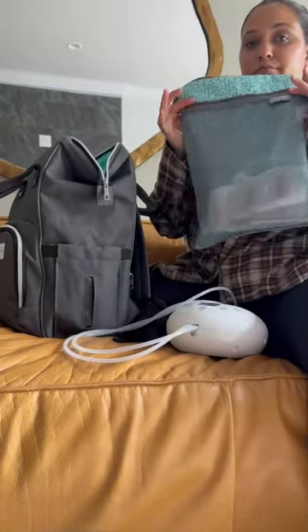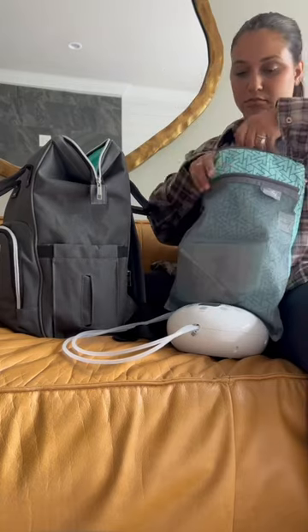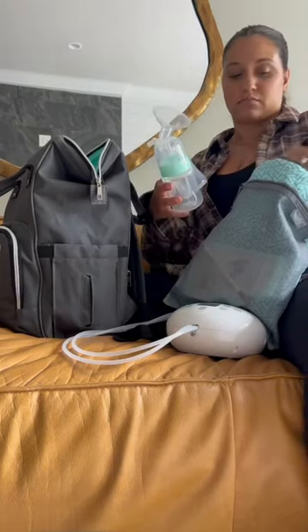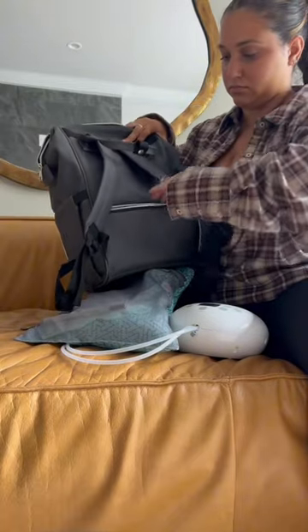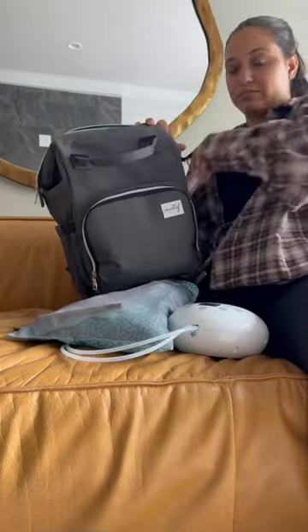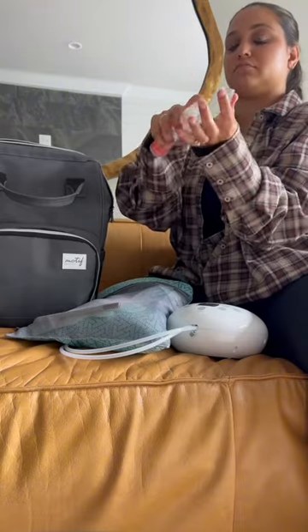A wet-to-dry bag that has a marker to label storage bags, and of course for all my pump parts and bottles. What I love about this bag is that the bottom half is a cooler, so I have an ice pack in it, and I can easily store my milk and keep it fresh.